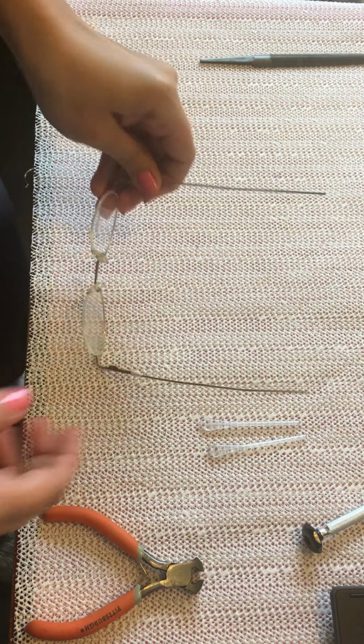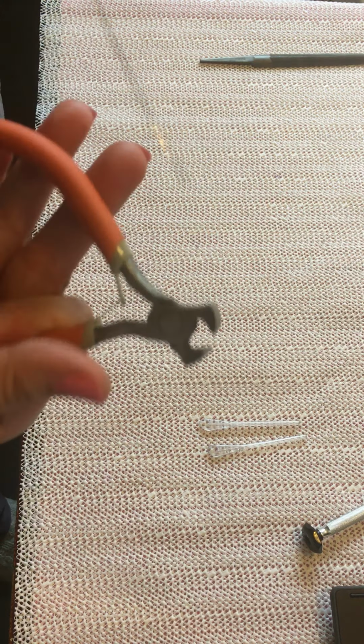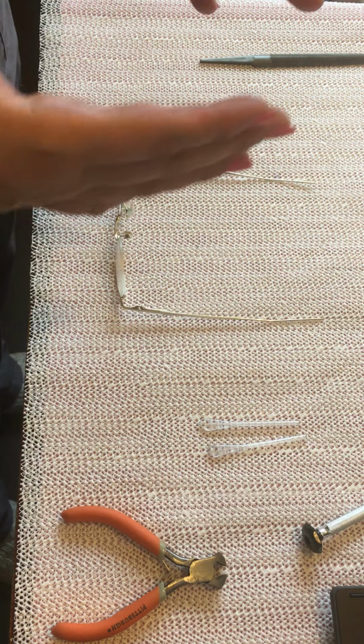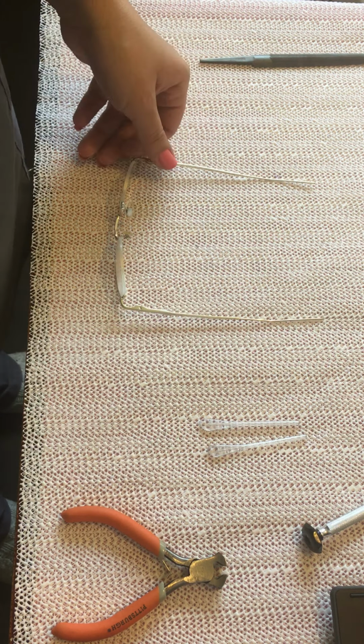Whenever we have them here, sometimes we can also shorten the length of this by our clippers. We could cut it like that. We would cut it to lessen the temple length. Maybe the patient's side, on the back side is not too long, and we could make it more comfortable. So it's for a better fit for the patient. Or we would replace temple tips in case they're old or they need to be exchanged or something.